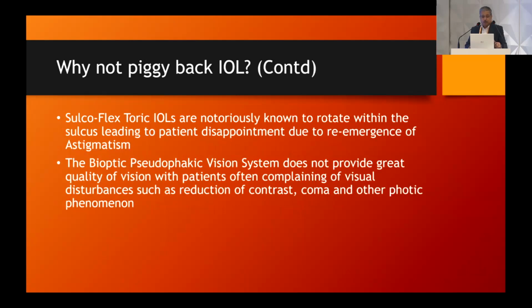Now, the Sulcoflex toric IOLs are notoriously known to rotate within the sulcus, leading to patient disappointment as astigmatism reemerges. And the bioptic pseudophakic vision system does not provide great quality of vision. Speak to someone who's had a bioptic procedure.